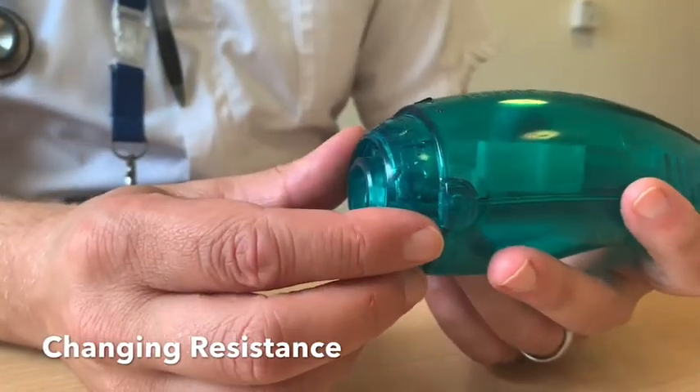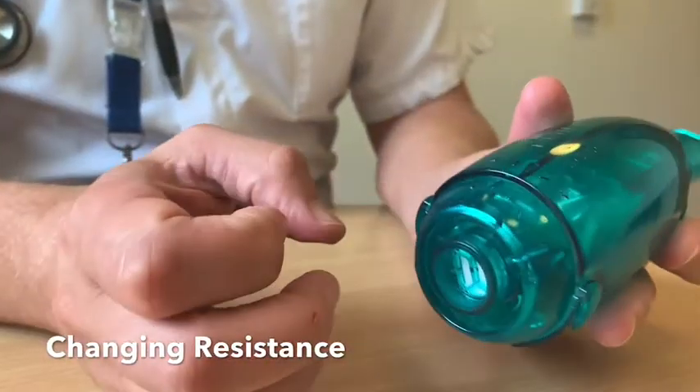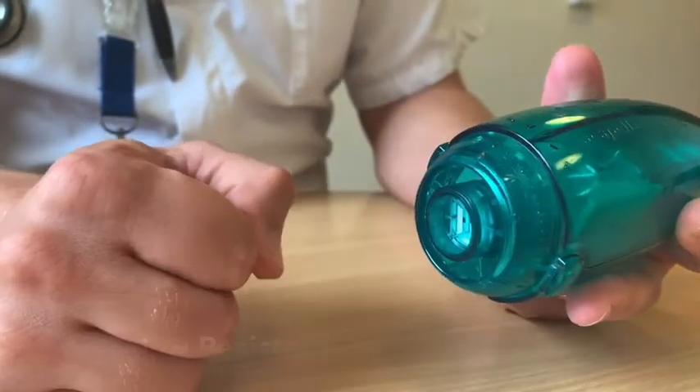If you're finding that breathing out for five seconds is too difficult, you can turn the number down between one and two. If you're finding it quite easy and you feel like you'd like to try harder to breathe out, you can turn it up to four or five.